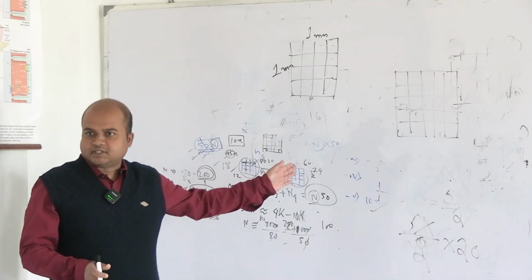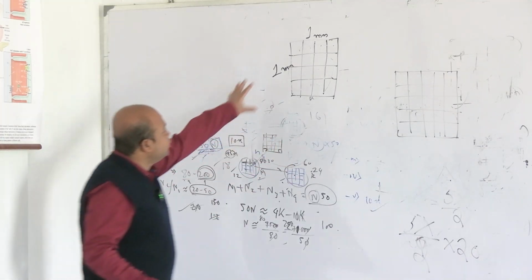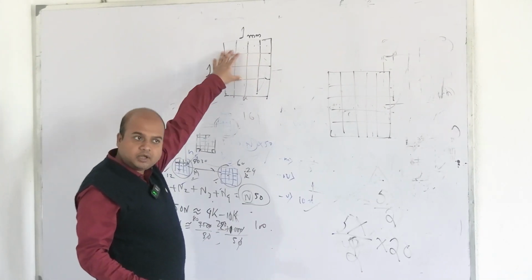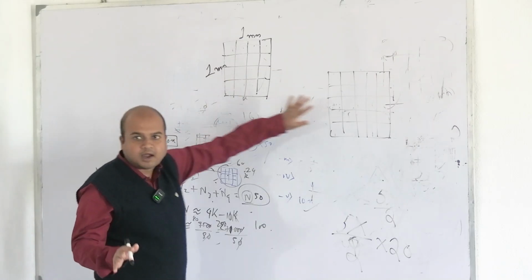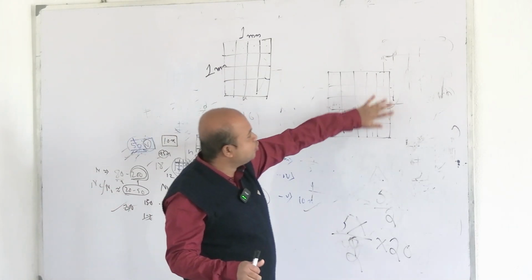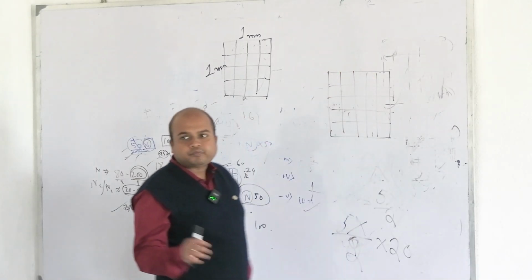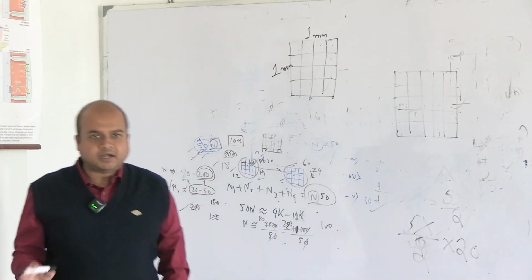So we divide this step further. So will it be possible to count all these 25? Like we are counting all these 16 in WBC. Actually, we are counting not 1, 2, 3, 4, 5, 6 up to 16. We are counting as a whole. Do you get it? In RBC, we are not doing it. Even then, it won't be possible as a whole. And will it be possible to count all 25? Perhaps no. We have to keep it as far as practicable as well.